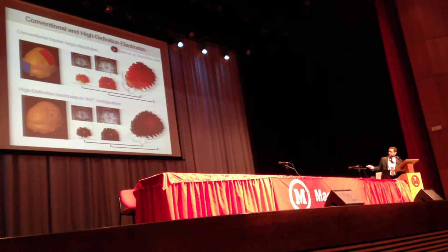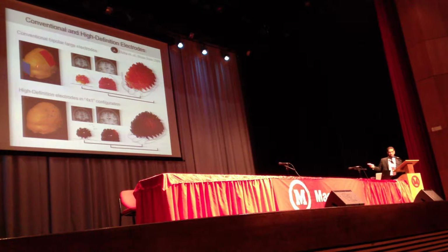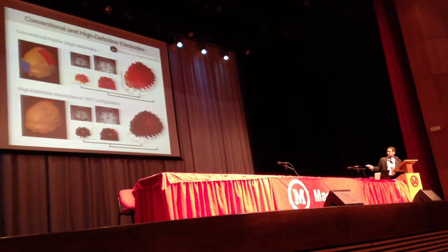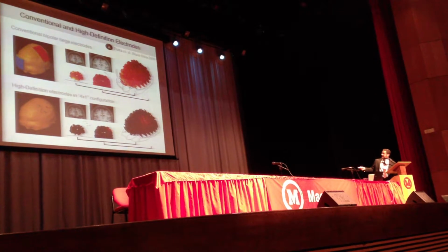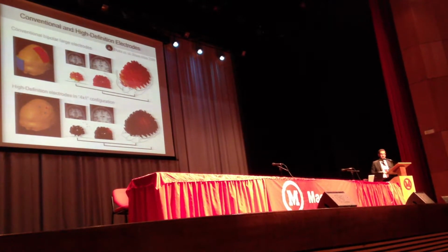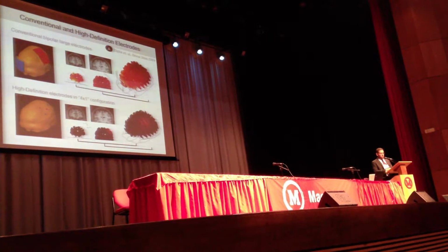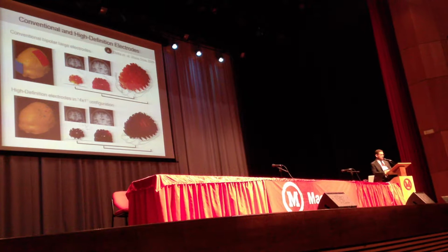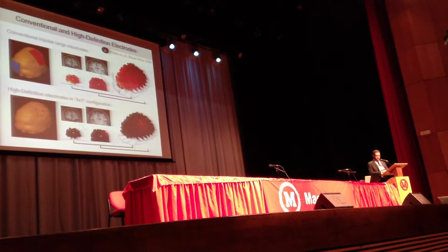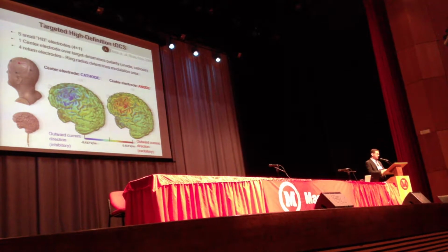Now you can contrast that with the 4x1 montage. In this case, instead of 2 large electrodes, we have 5 small electrodes. And just without any quantification, just by eye, you can see that there is a pretty significant difference in the focality that you can achieve between those 2 approaches. Now to be clear, I've selected some rather extreme examples here to make the point. We can look at this 4x1 montage in a little bit more detail.